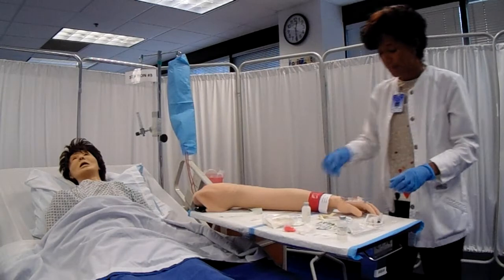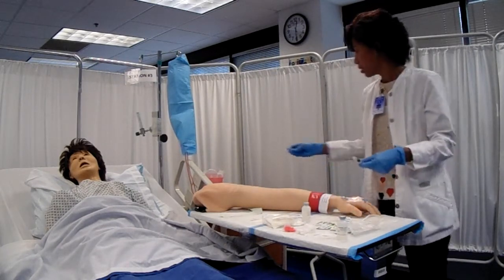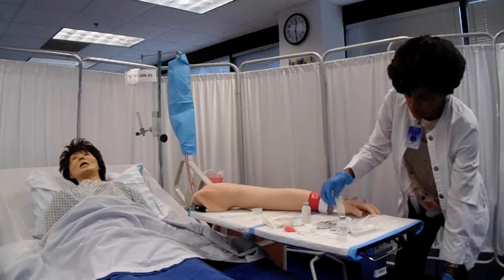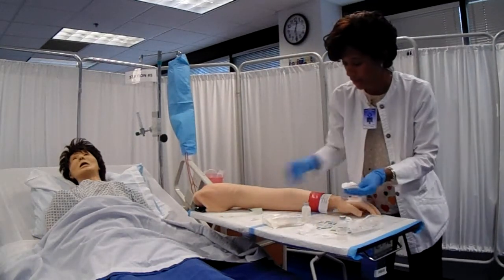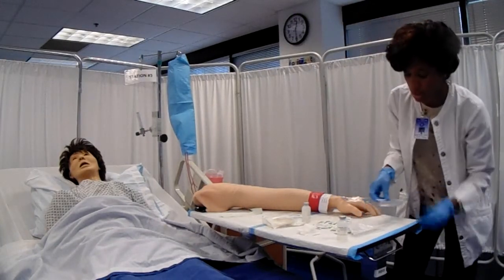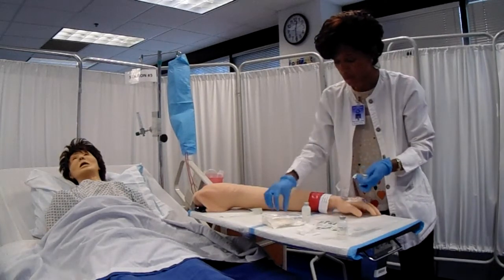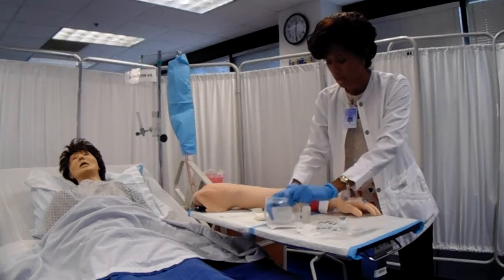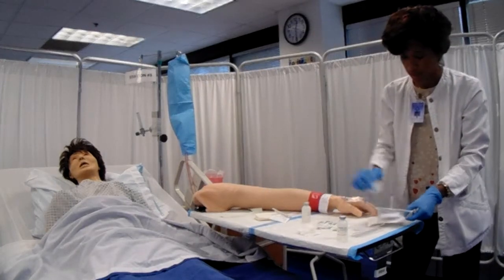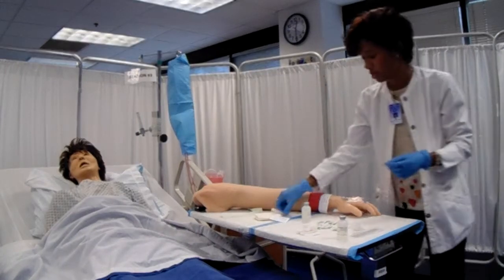Okay? At this time, I'm going to go ahead and dispose of my equipment and clear up the site, and then I will deglove, perform hand hygiene, and label your site. And on that label, I'm going to place my initials, the date, and the gauge of the needle. Any questions? No? Okay, great.